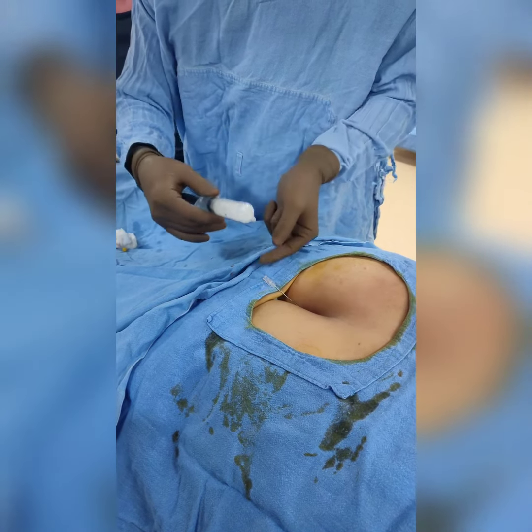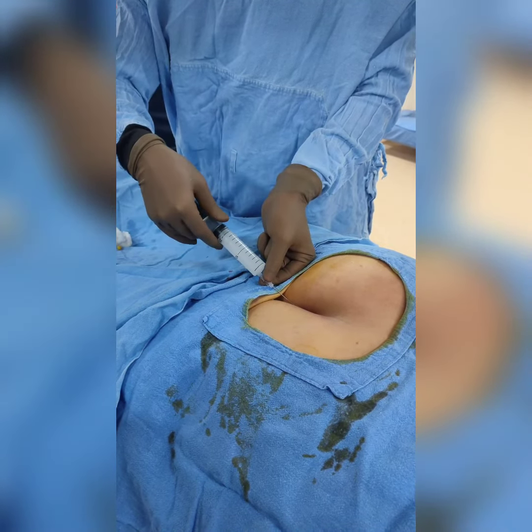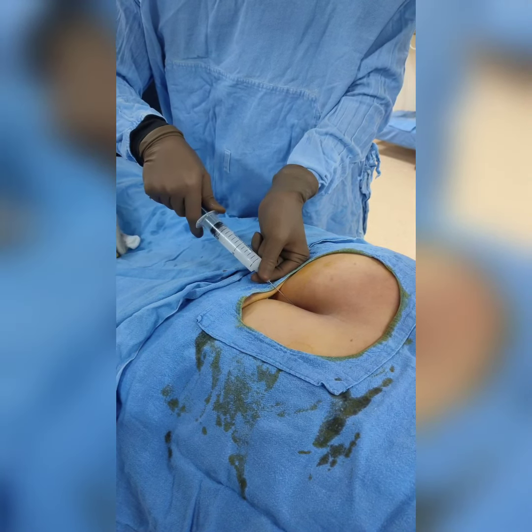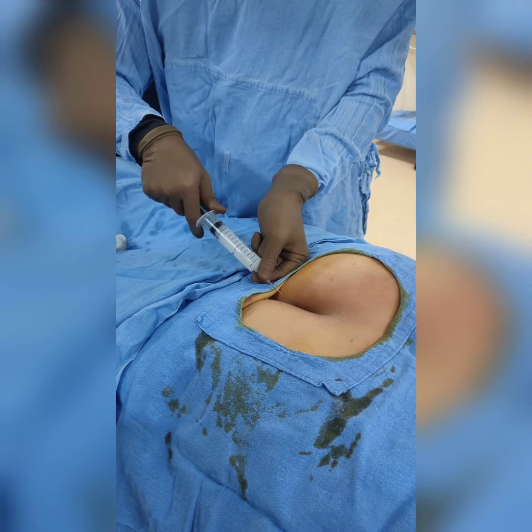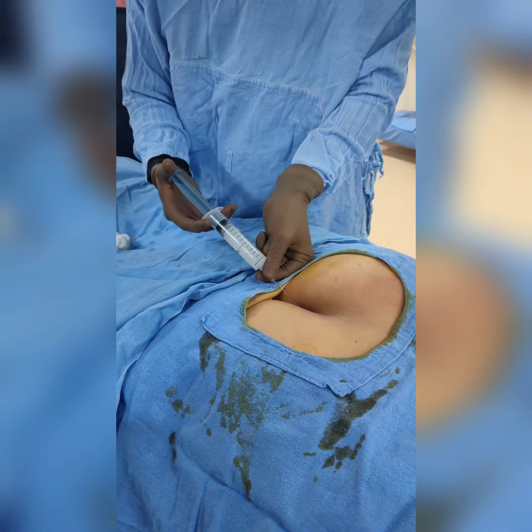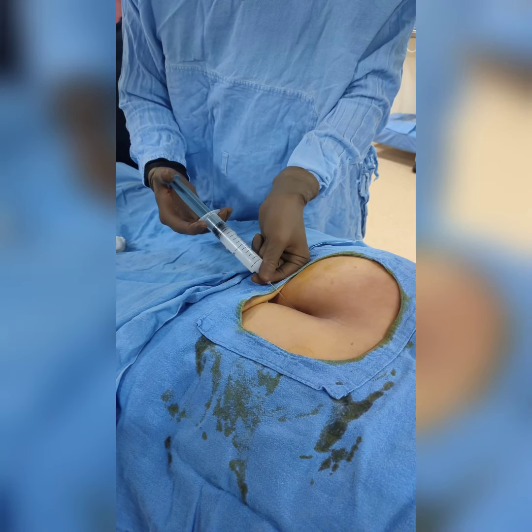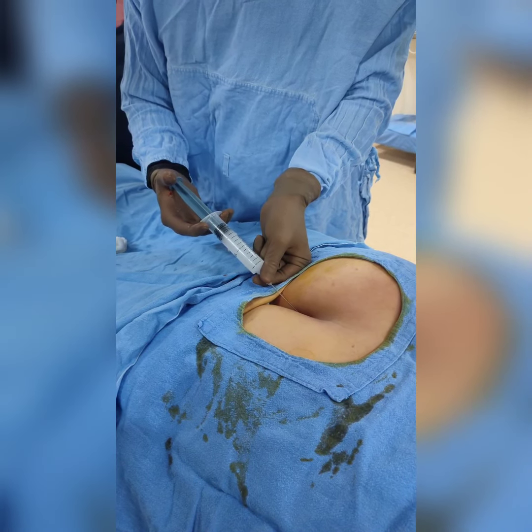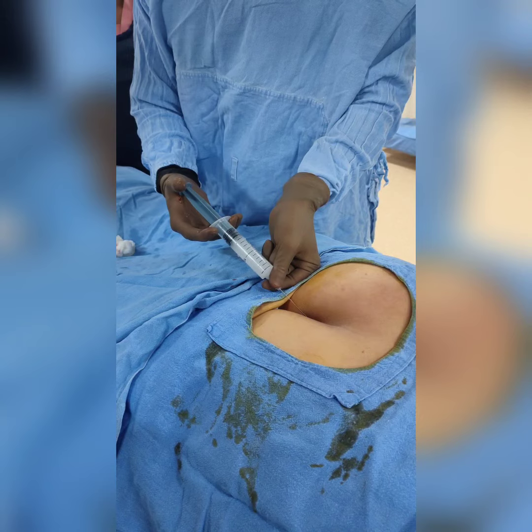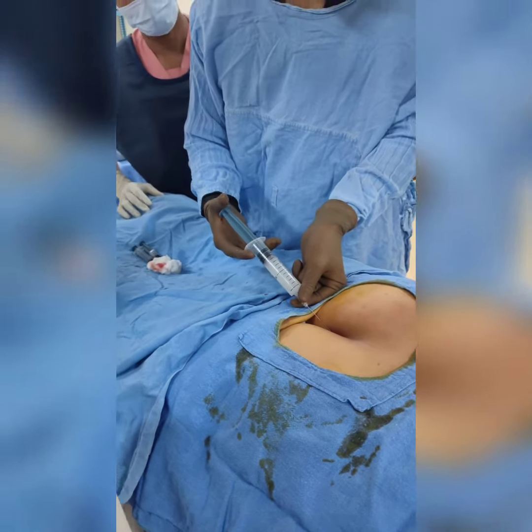This is lignocaine, steroid, and saline — I am going to inject it now. Before injecting, we have to aspirate. I can see that there is nothing coming out. Now I am slowly injecting into the epidural space, which has been confirmed under C-arm.